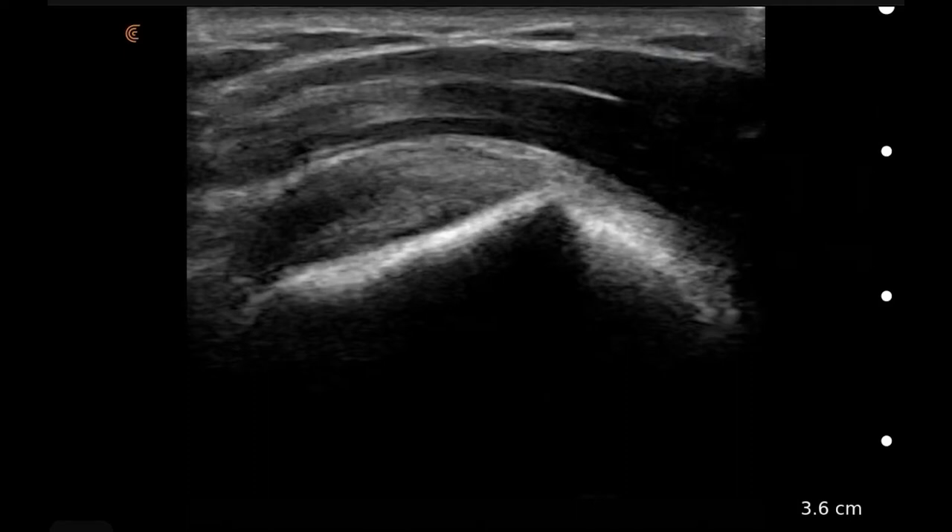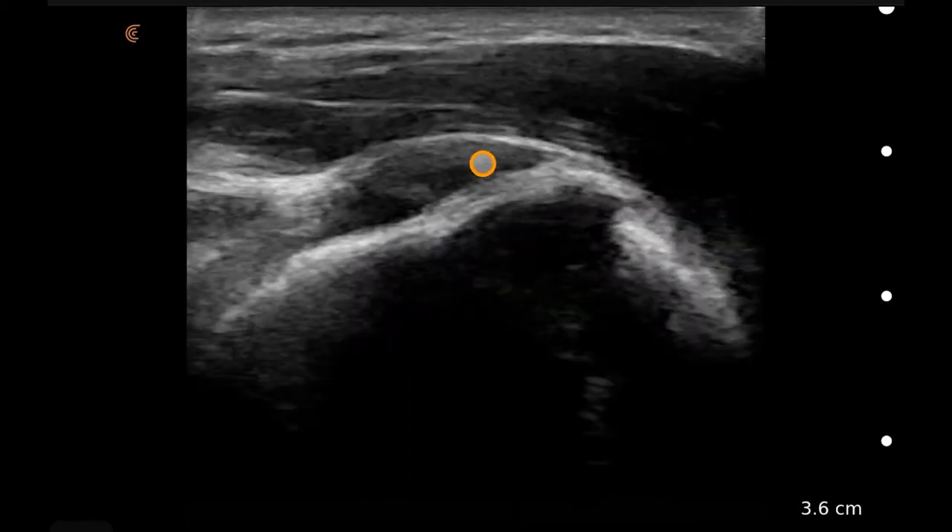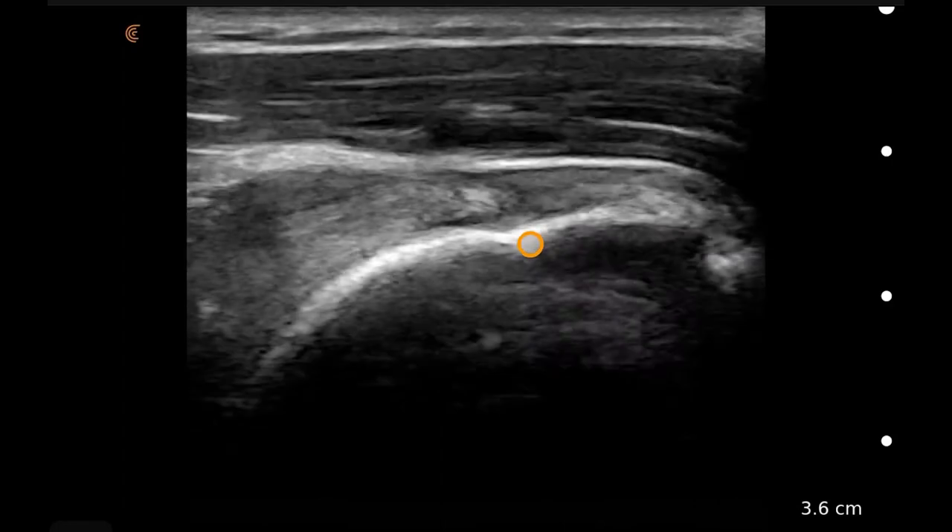This is a scan with a linear transducer on a musculoskeletal preset in the longitudinal plane of the rotator cuff. Here we have the rotator cuff and its attachment to the humeral head.